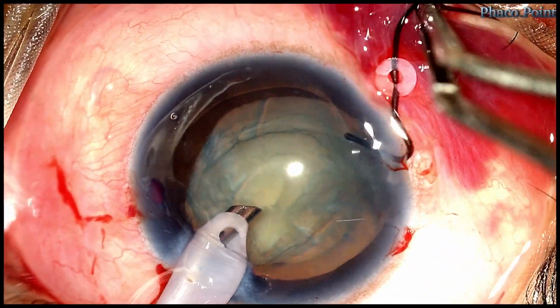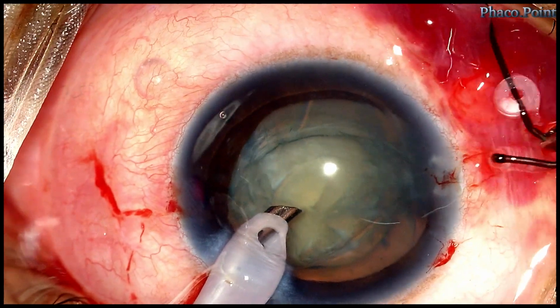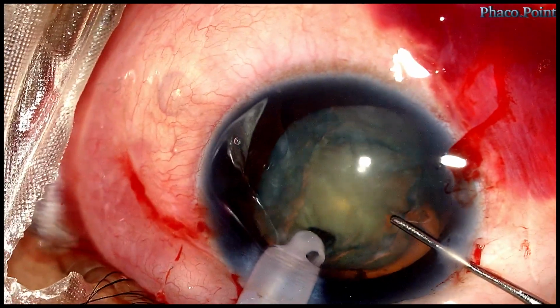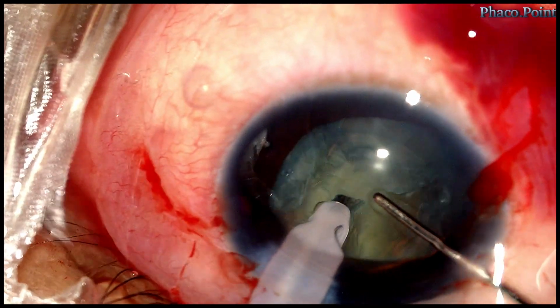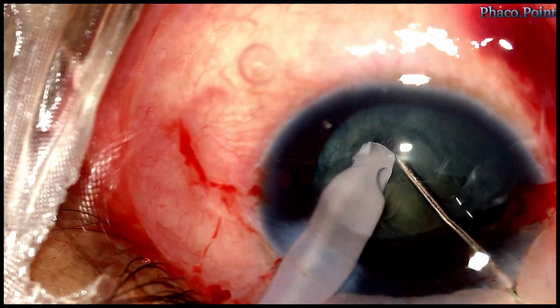hook slips off. I try on multiple attempts to hold on to the capsular bag again, but am unable to do so. I choose to remove it because now I do have a CTR in the capsular bag and I believe my bag is fairly stable. Let's now proceed to watch the nucleus management.